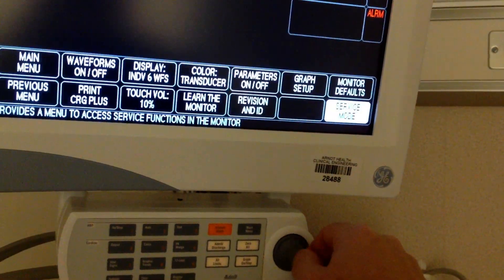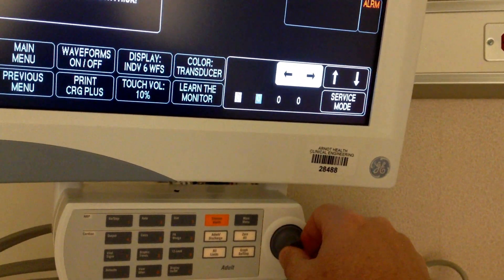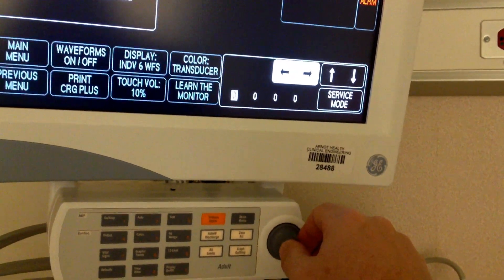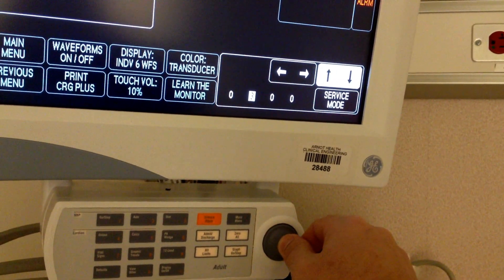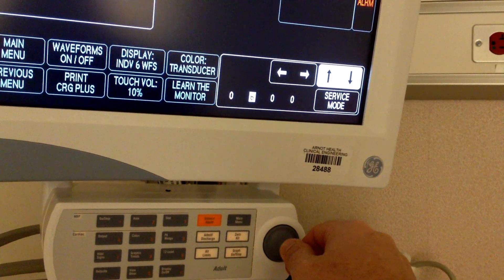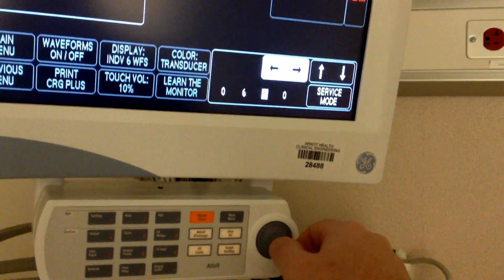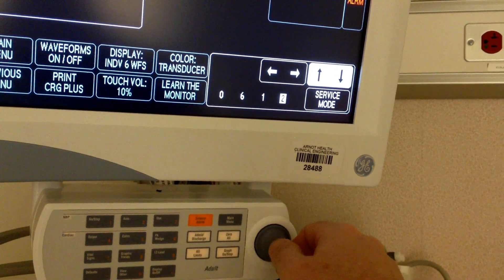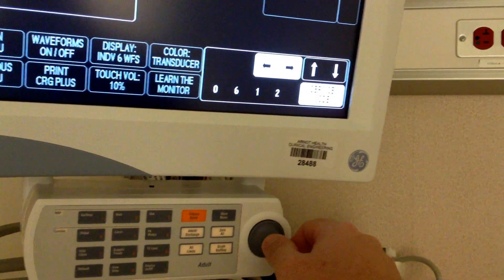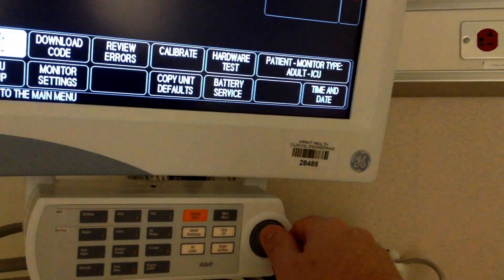Scroll across to service mode and we'll enter the code 0612 for today's date, the 6th of December. Here we are in service mode. I want to set the time.